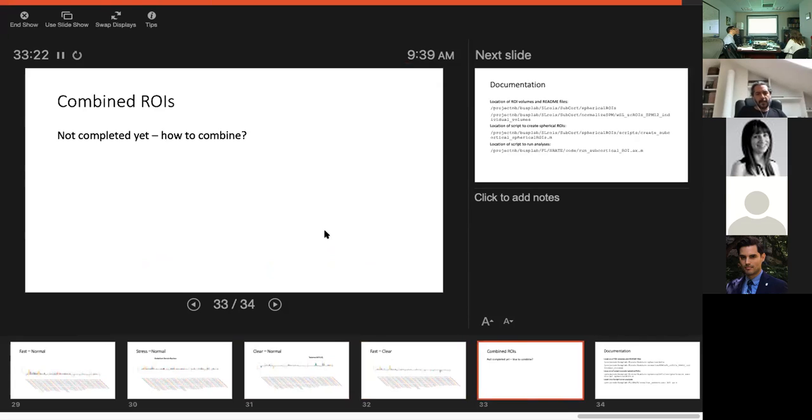That is tricky. To make that decision, what I'd like to see is the ROIs, how they line up, what they look like. And it would also be nice to see, for a given ROI, to the degree that we can compare ROIs, just the responses, even for the speech minus baseline.